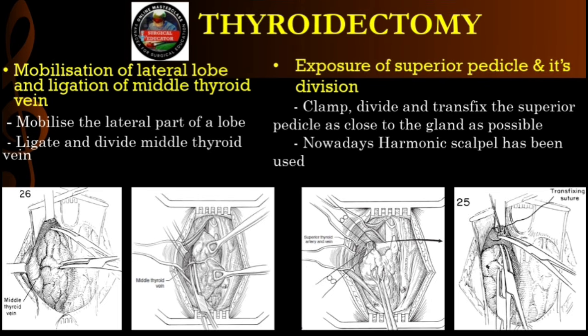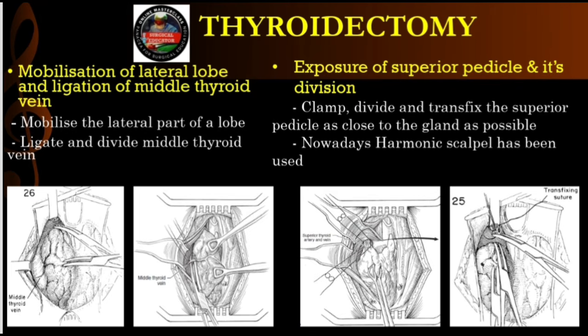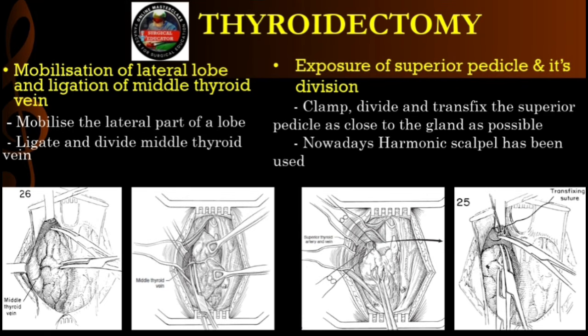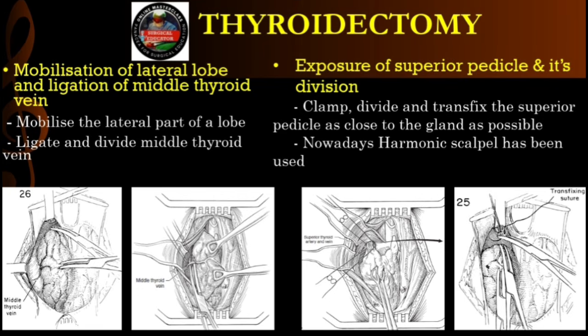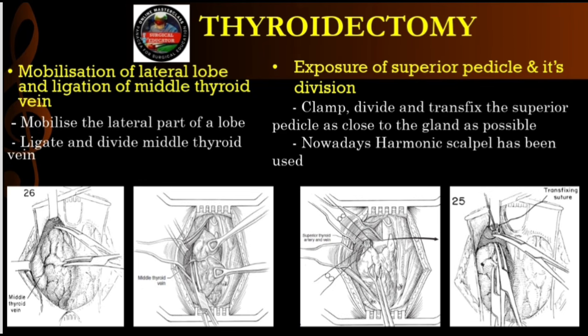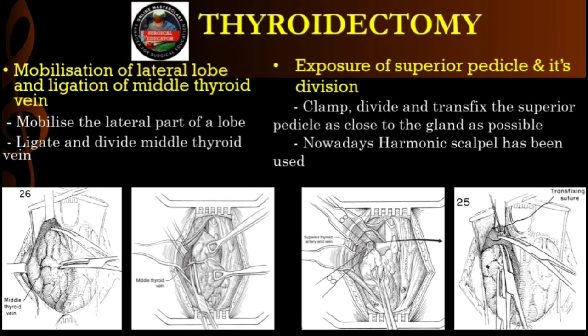And the torn vein retracts back into the tissue, right? Exactly. It shrinks back into a pool of rising blood. You can't see it. If you blindly throw clamps in there, you'll crush nerves or arteries. You must handle the gland with extreme gentleness, spot the vein early, tie it twice, and cut it cleanly. Okay, so lateral tether is cut. The gland pivots. Now we can pull it down to expose the peak of the mountain, the superior pole.